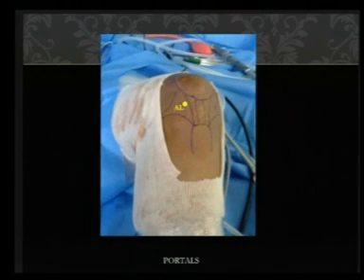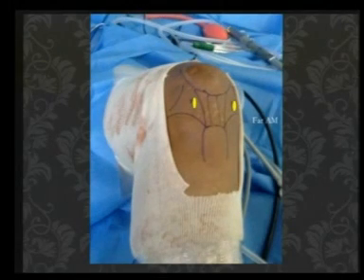If you see this picture, this anterolateral portal is one thumb breadth above, just lateral to the patellar tendon. That's a standard viewing portal. But that itself could be different, especially when you have an intact ACL and you want to do a PCL reconstruction, you have to go slightly higher. The anteromedial portal, which traditionally is said to be on the same line as the anterolateral portal, a centimeter medial to the patellar tendon, could vary a lot depending on what you're going to be performing.